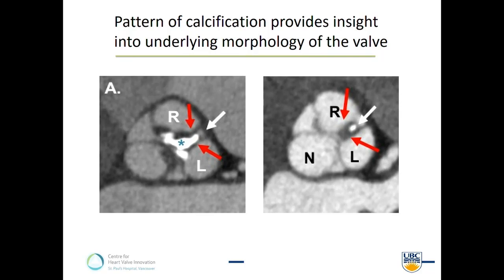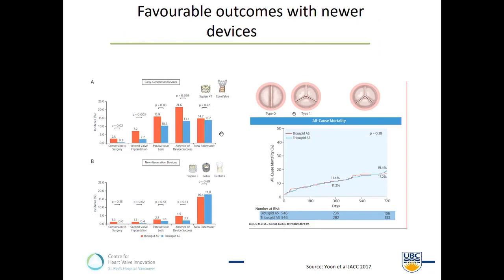In the same way we have some patients that present with aortic dilatation earlier and not. So what do we know from this very elegant paper from Dr. Yoon and Raj Makkar, a large registry, is that with newer devices, these patients with so-called tricommissural bicuspid valvular disease do very well as compared to those with tricuspid aortic stenosis. So there's absolutely no reason why Dr. Waxman and his colleagues shouldn't consider these patients good candidates for TAVR.